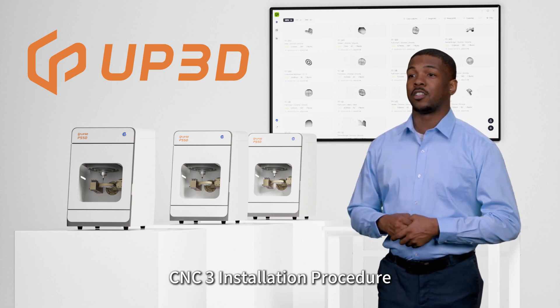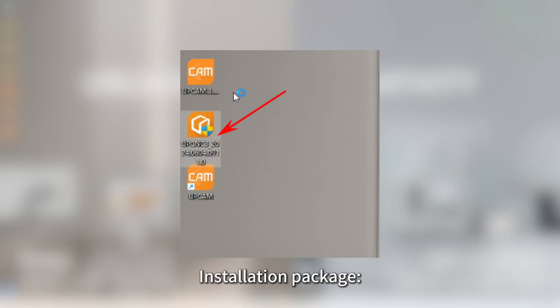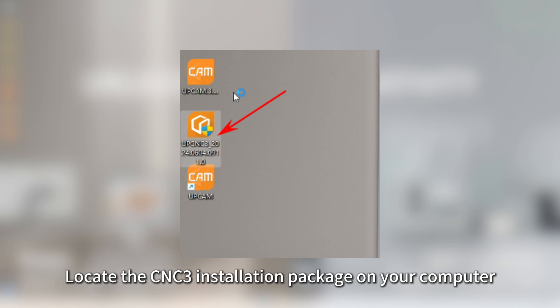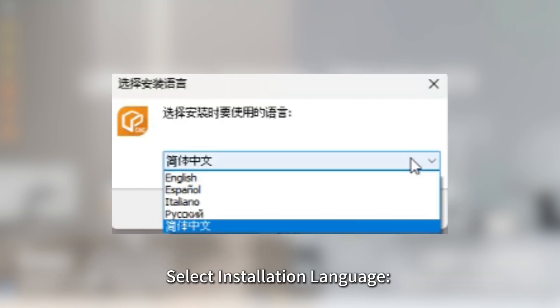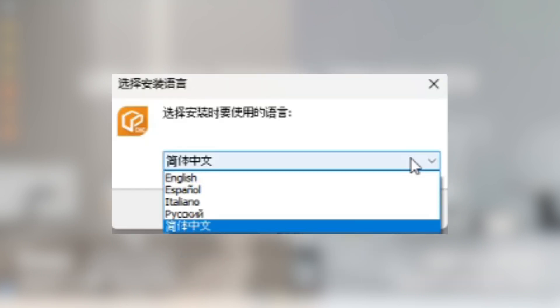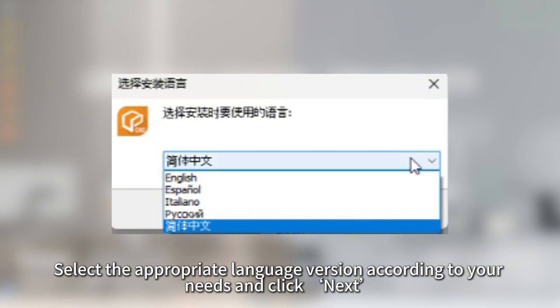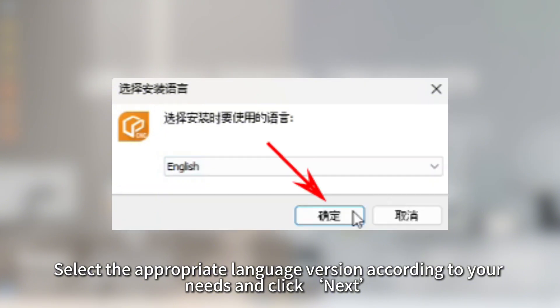CNC3 Installation Procedure: Locate the CNC3 installation package on your computer and double-click on the package to begin the installation. Select the appropriate language version according to your needs and click Next.